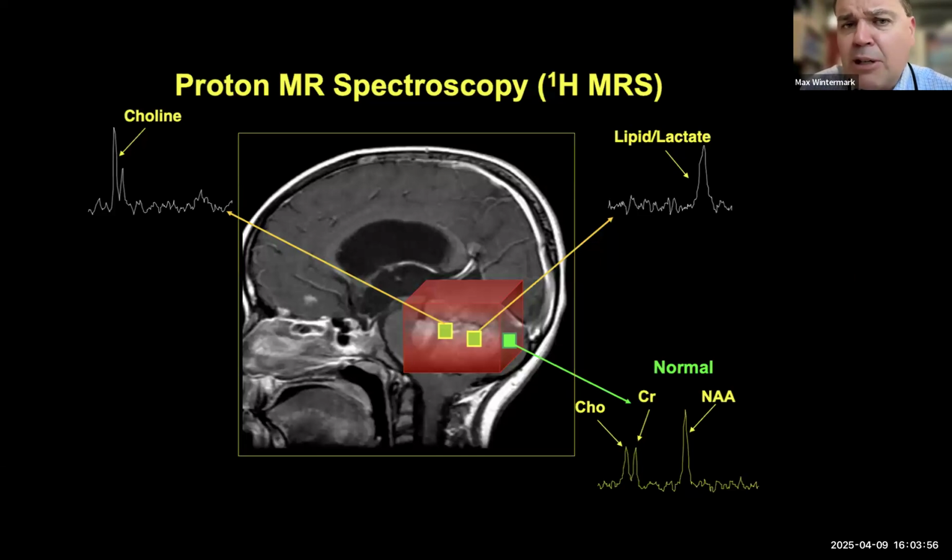Like I told you earlier, spectroscopy is not specific either. It's not that you see that pattern and you can say, okay, it's a brain tumor, because, for instance, an active MS plaque could give you the same pattern. You could also have a decrease in NAA, and because there's increased turnover of glial membrane, you could also have increased choline. So typically the NAA is not going to be decreased as much, and the choline is not going to be increased as much, but you are going to see similar types of changes, again, less pronounced, but similar change.